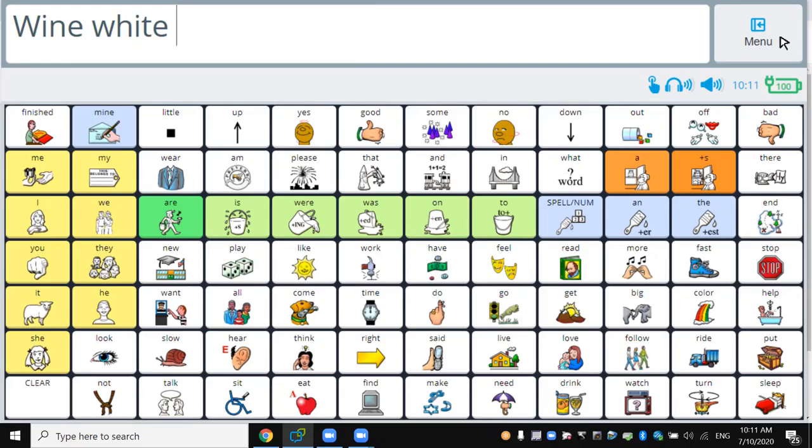I really don't like setting vocabularies for, this is me personally, and I know people disagree, but I don't like having circle time vocabulary because in circle time somebody pulls my hair and I want to tell them to stop or it hurts or quit. In circle time I want to flirt with a girl next to me. I like to use vocabulary builder to give you the word you want to say when you want to say it. But others could have a different opinion. So I'm going to give you an activity I could live with.